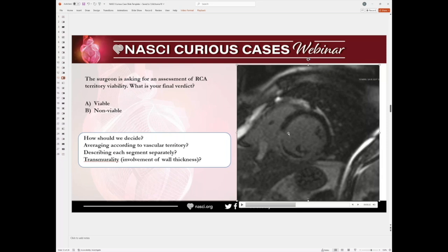So you are evaluating or predicting if the myocardium will be viable or not regarding the extension of infarct size and presence of MVO? Yes, thank you so much. So you don't look at the myocardium immediately. That's what I was thinking. And thank you so much for the contribution.